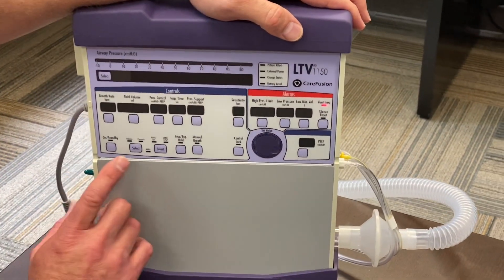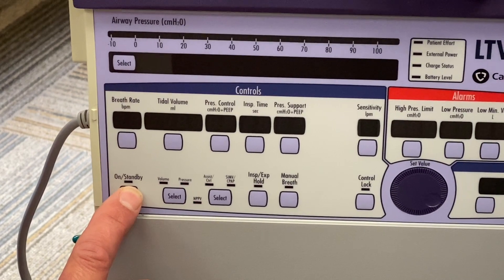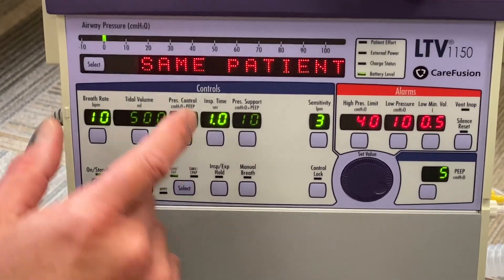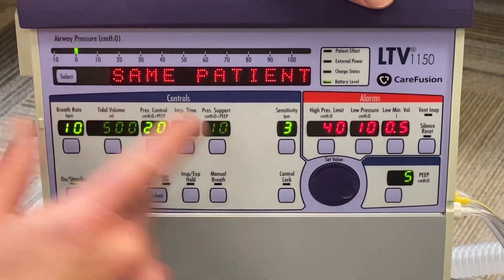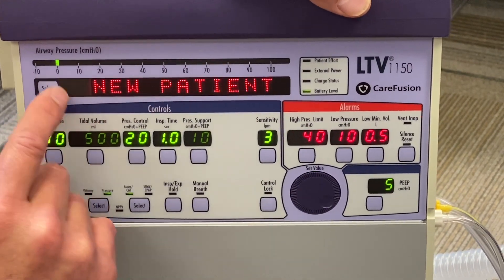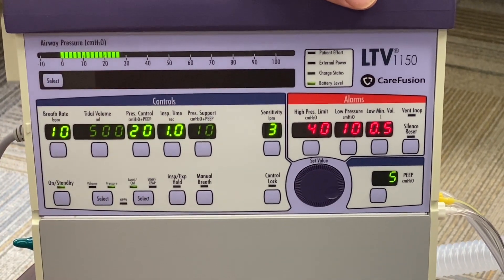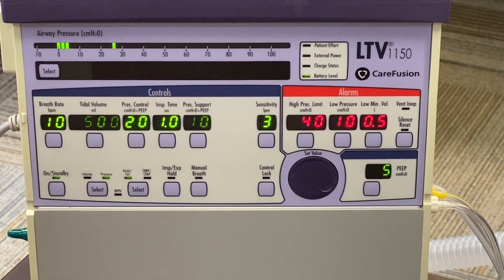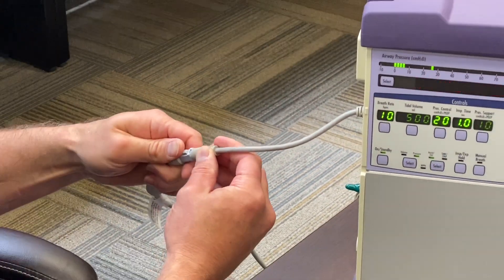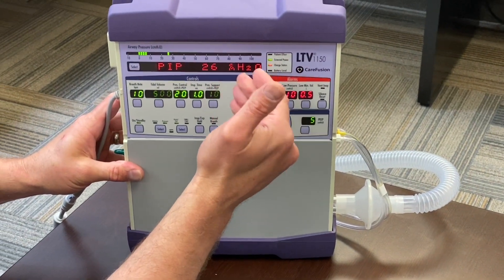Getting to the ventilator itself, we'll start with the main controls. Here you have your off and on. Once the ventilator comes on, it'll ask if it's the same patient or if you're starting a new patient. You can scroll to new patient — you have to select either option. If it's a new patient you can input new data; for this time we're going to stay on same patient. Alarm silence is here; once the problem is fixed it'll reset itself.